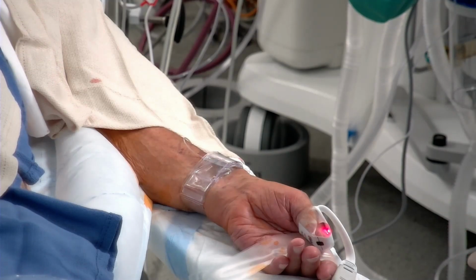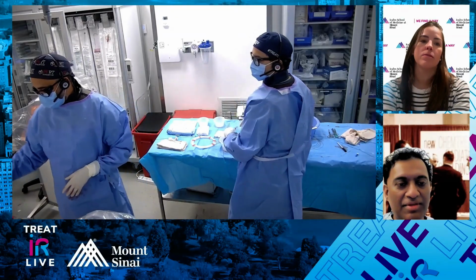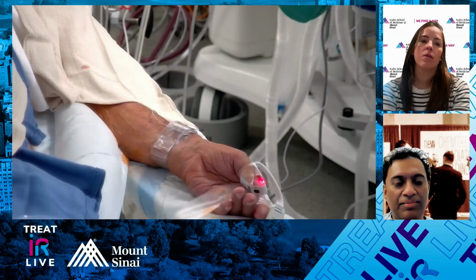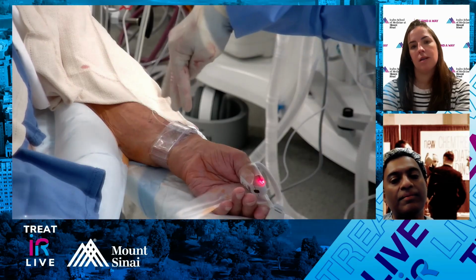Another question. You know how you have the tubing going towards the opposite of the fingers. Would it matter if you flipped it? The TR band? Say you flipped it the other way. Yeah, the problem is the balloon is going to be on the wrong side, right? Correct. Because the balloon's only on half of the TR band.